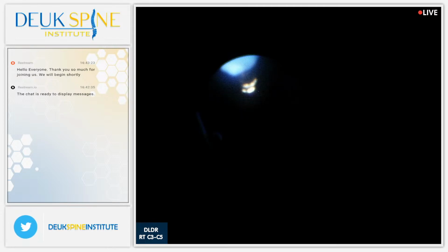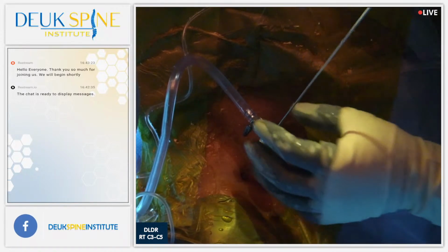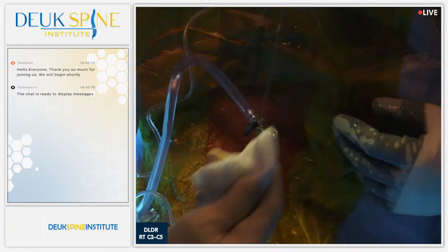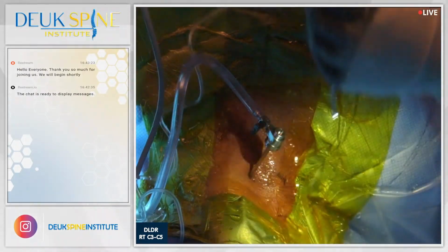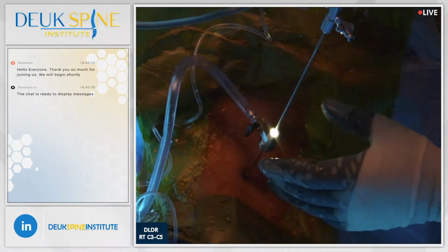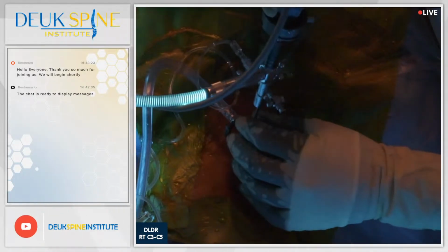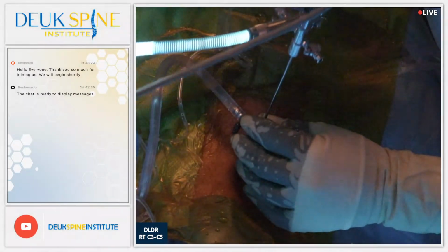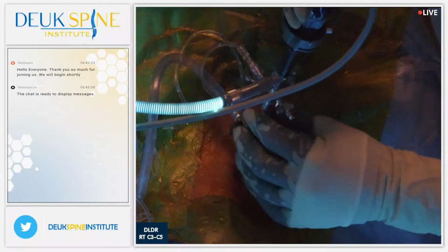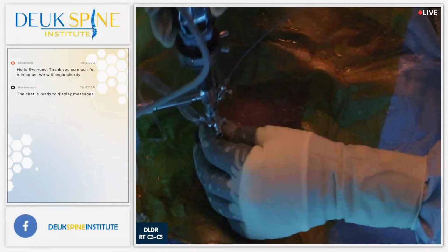I don't think I got it. I can sort of see it. There, we got a piece. Again, a herniated disc is not one piece of herniation, it's a lot. In his case, a lot. These are all pieces of herniation, new ones.